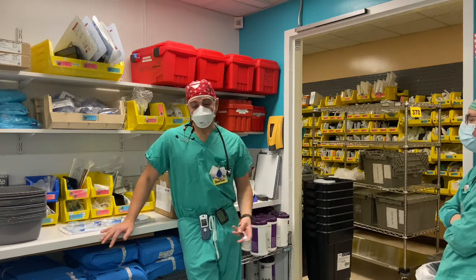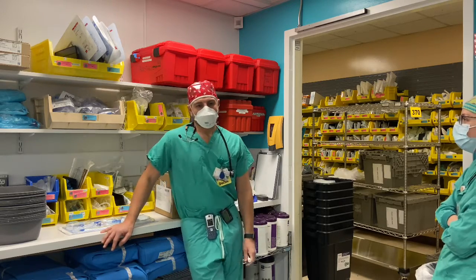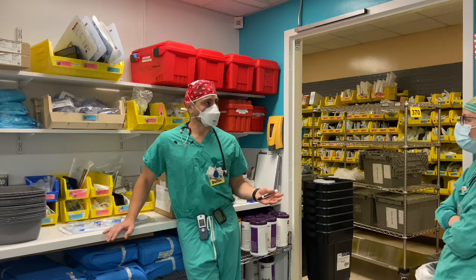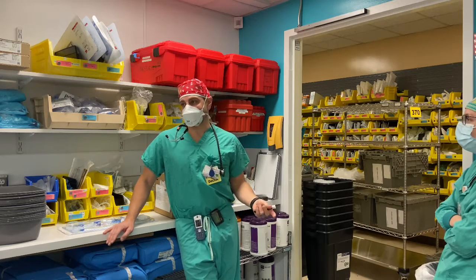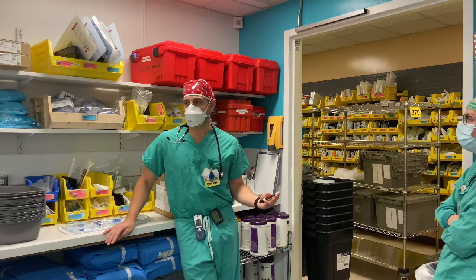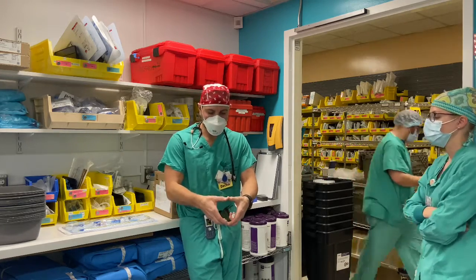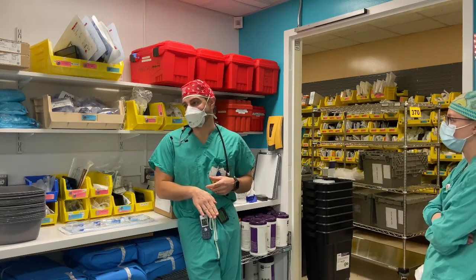So let's say we need to actually help somebody breathe during an anesthetic, so positive pressure ventilation of some sort. The two most common things we use are endotracheal tubes or LMAs. LMA, as you probably know, stands for laryngeal mask airway. It's designed to sit above the glottic opening and ideally have a patient breathing spontaneously. You can add some positive pressure, but the more positive pressure you add to an LMA, the more likely you are to break the seal of the cuff that's just resting on the mucosa. The harder you blow, the more likely it is to pop that seal off, and then you're at risk of blowing air down into the esophagus as opposed to the trachea.